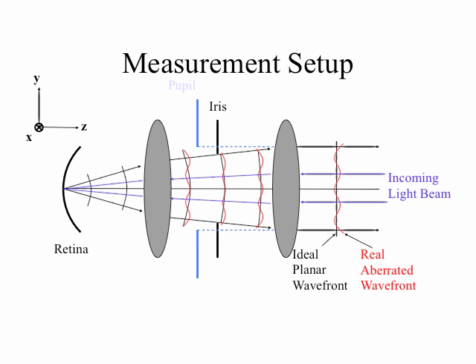So the patient looks at Sirius, the dog star up in the sky, and the rays of light coming from the dog star, of course coming with a 0 vergence, they're coming with this perfect planar wavefront. Well, perfect if we were out in space, but humor me. And they strike the eye, and the imperfections in the eye produce an aberration to this wavefront. So we're interested now, going forward, in measuring what the aberration is. How are we going to do that?